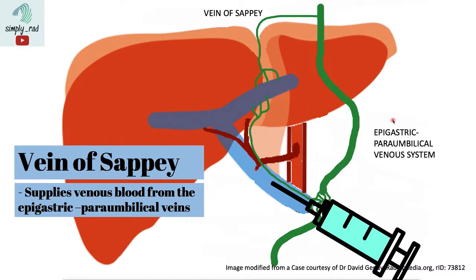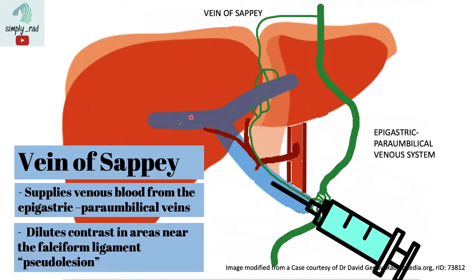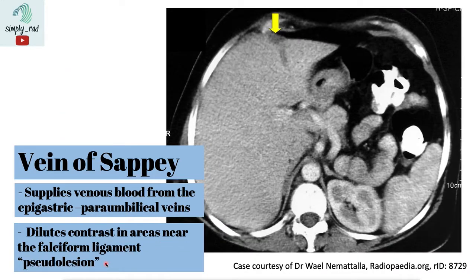During the portal venous phase, where there is maximal enhancement of the liver via contrast within the blood flowing in the portal vein, areas supplied by the vein of Sappey will have extra blood without contrast. This creates a dilution of contrast in areas near the falciform ligament, creating a pseudolesion — areas of hypo-enhancement in that typical area.